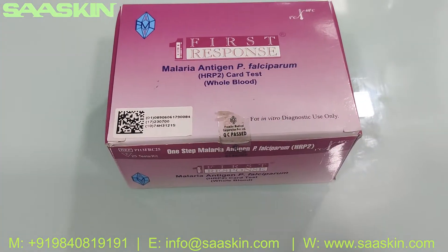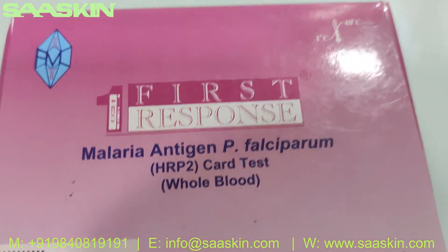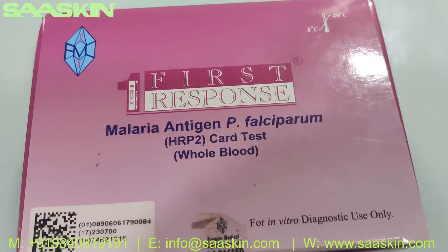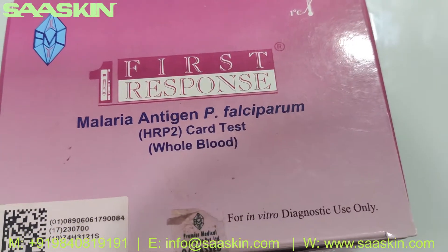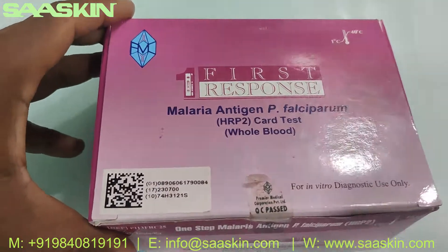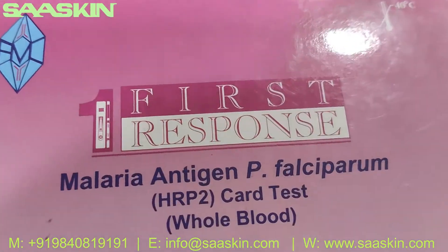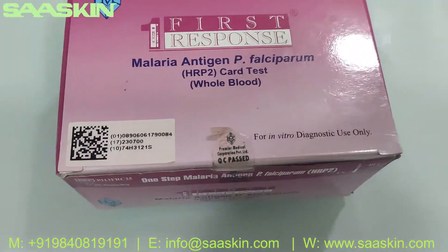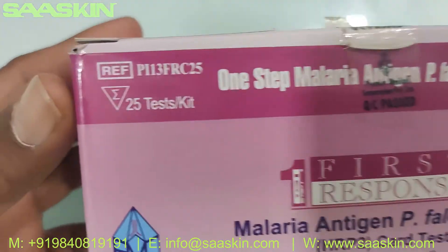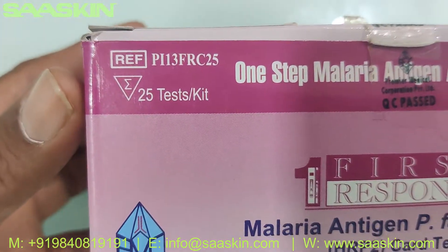Hello everybody, today we're going to see the unboxing of the First Response Malaria PF Rapid Test Kit, basically for the detection of the antigen P. falciparum. This is from Premier First Response — the brand is First Response — and this is a WHO pre-qualified kit. You can see the reference part number here; this is the 25-test kit in a box.